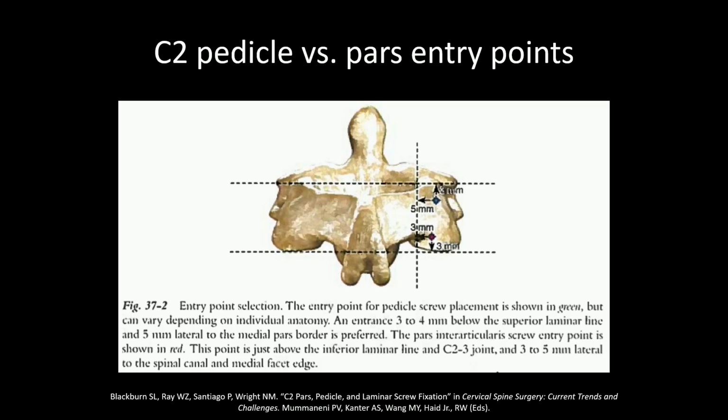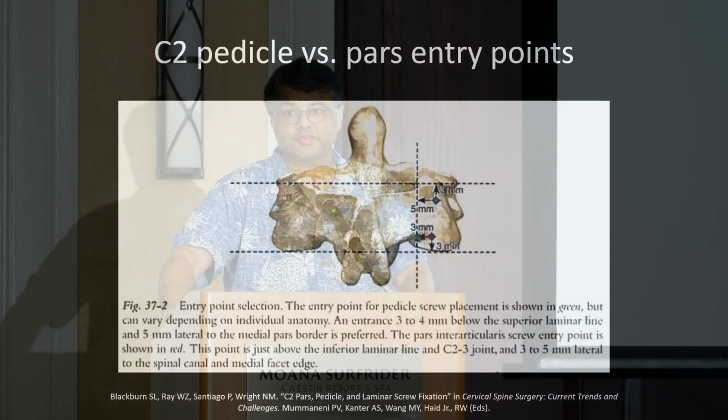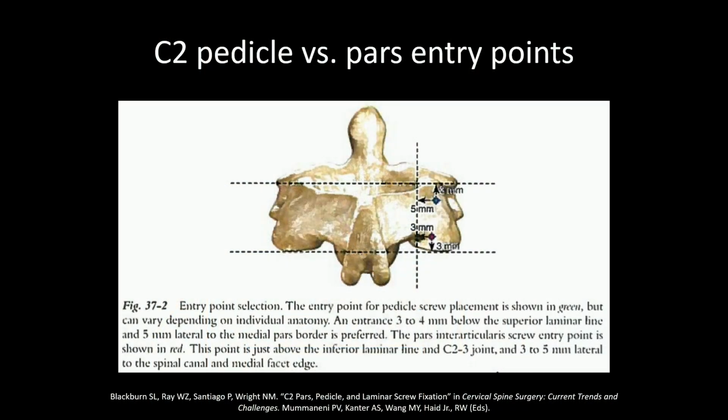I guess I put it up here, but just to reemphasize that, where's Sam? Sam, what's the entry point for a C2 pars screw? Yeah, that's right. And Tim, what's the pedicle screw entry point?